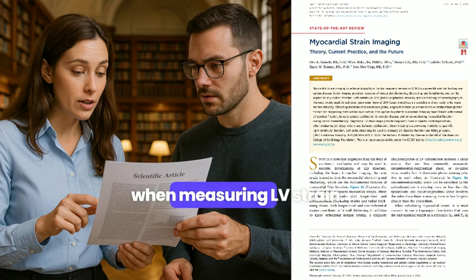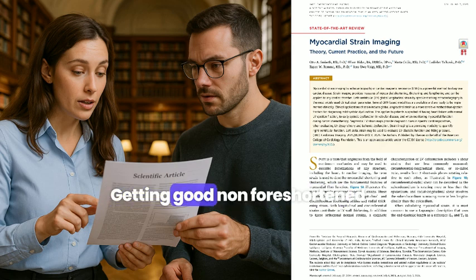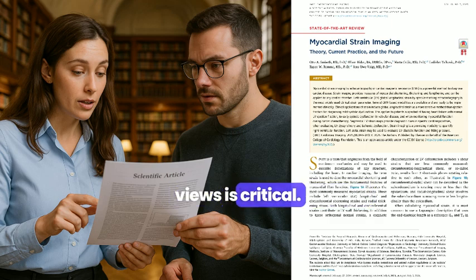Any pitfalls when measuring LV strain? Definitely. Getting good non-foreshortened views is critical.